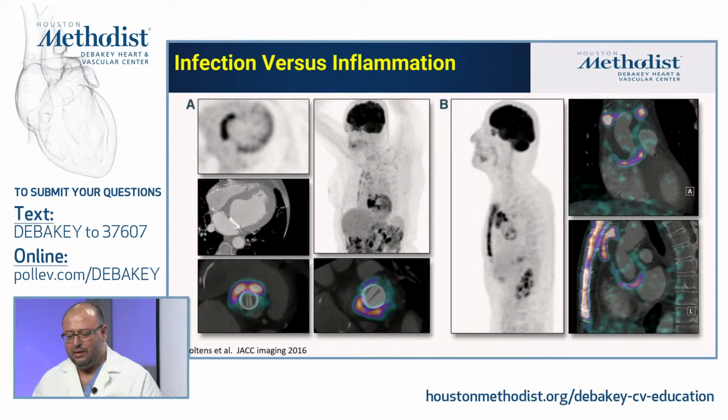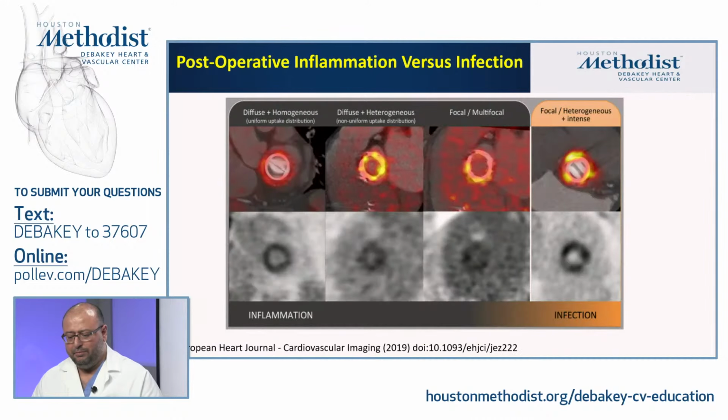You can see that there is significant inflammation around the sternum, but also all through, and it is more diffuse. It's unlikely that infection is this bad and the patient is not in hemodynamic compromise.